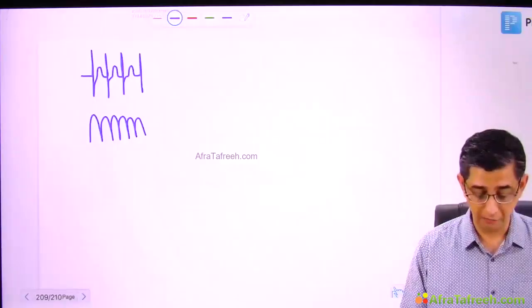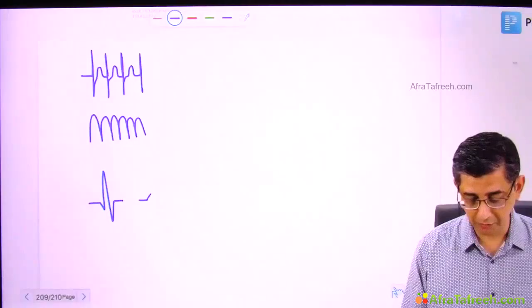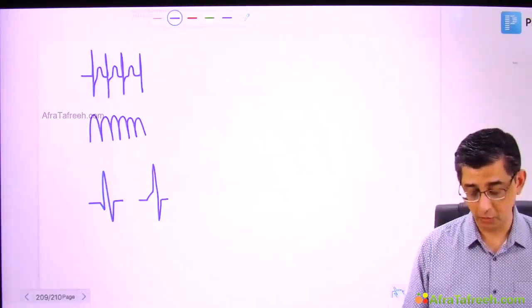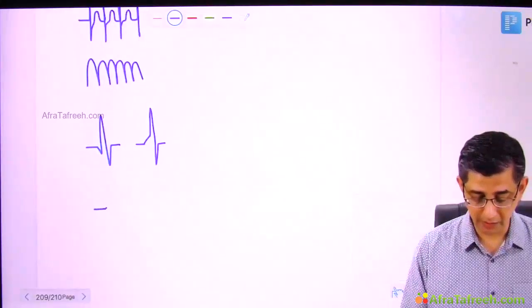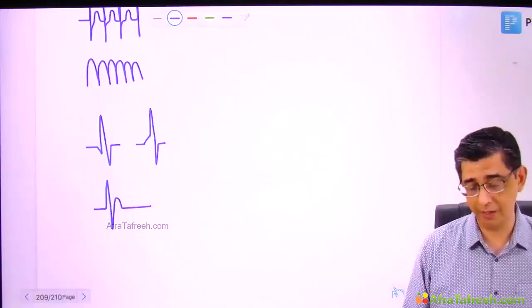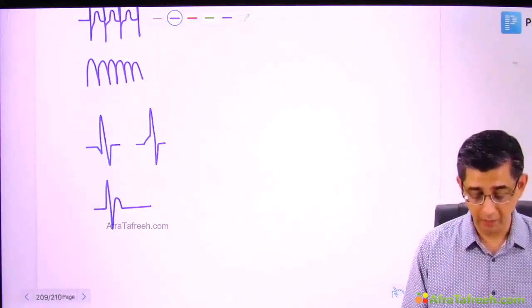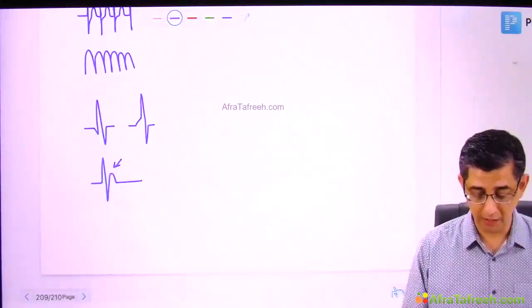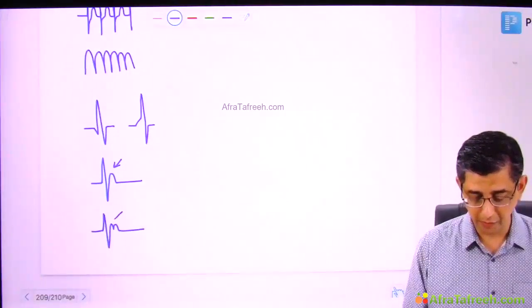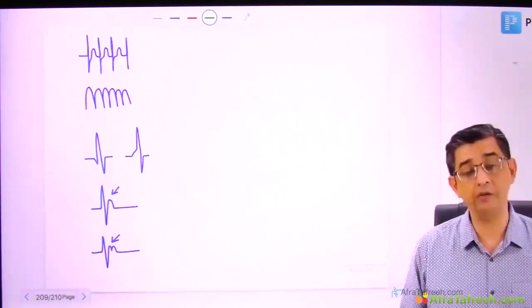In fact, whenever we talk about QRS complex, you always have to watch out for a change in the slope in the upswing of the R wave, that is a delta. You have to also contrast this with what I draw next as J wave / Osborn wave. You see, I have already explained to you that the end of the S is what is technically called the J point or the isoelectric point, but now I have drawn a J wave, and lastly I am highlighting, at the same area but in a different way, a wave that is called an epsilon wave. Let's just quickly recall the important information here, guys.